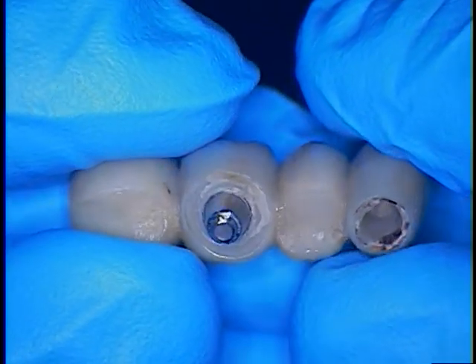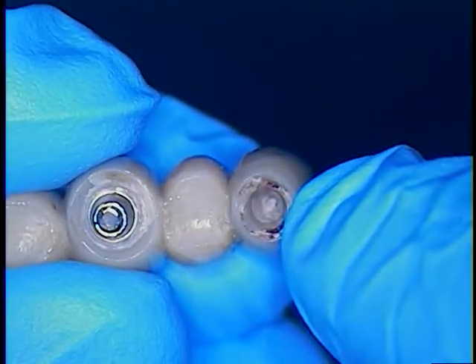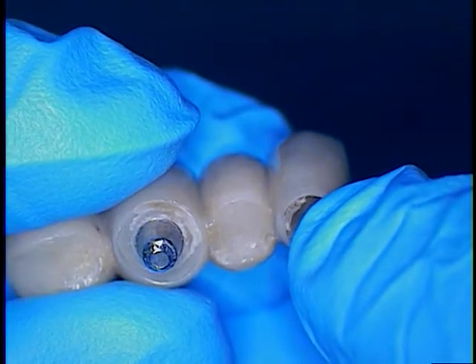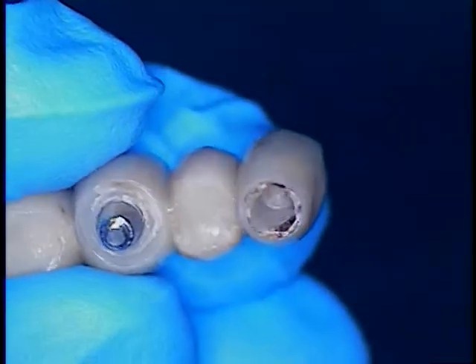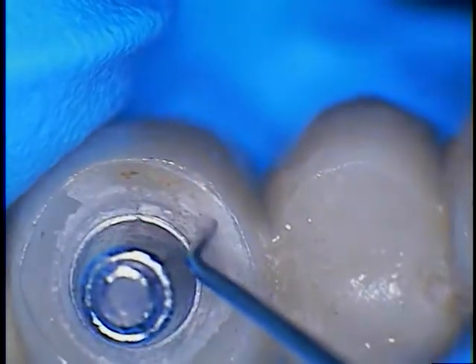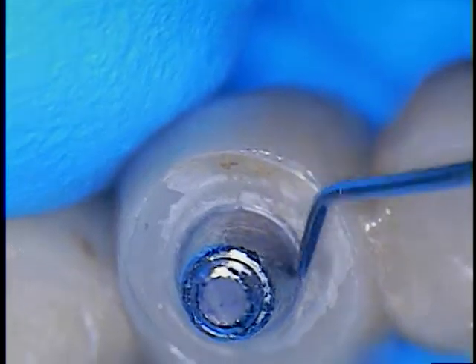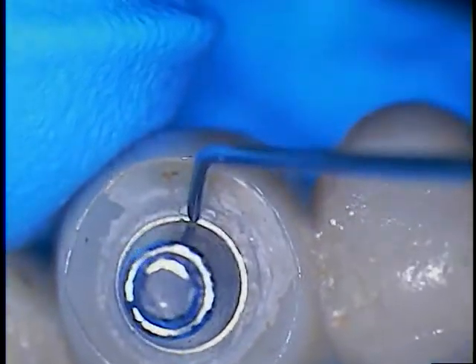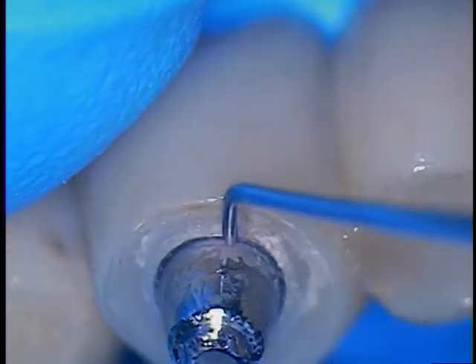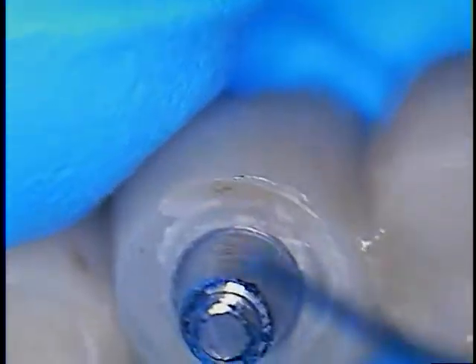A prior attempt was made by another office to cement in the bridge. There's an abutment — hopefully we'll see that metal titanium abutment on number 28 in the mouth. Here's number 30. You can see the remnant of resin cement. So not only was the bridge cemented down on top of the abutment, but the abutment and bridge together were cemented into the implant. I'm expecting to see some type of resin composite cement down in the implant itself.